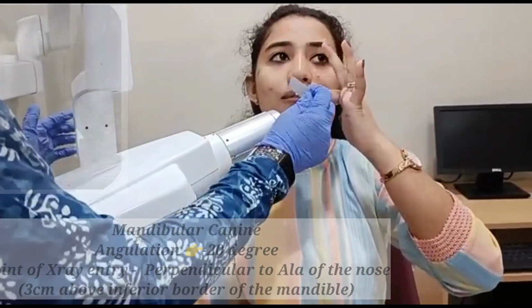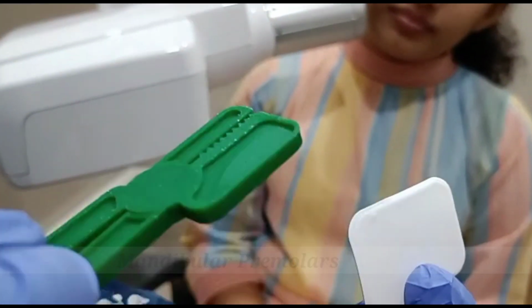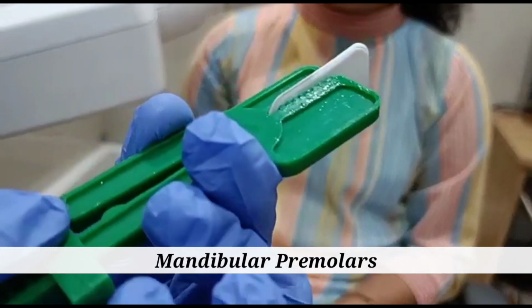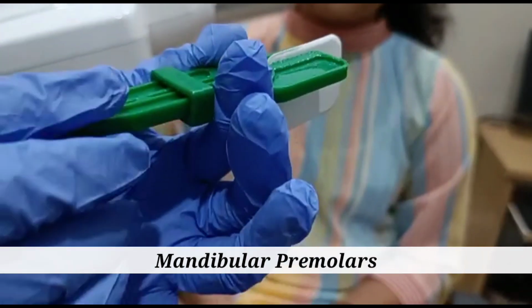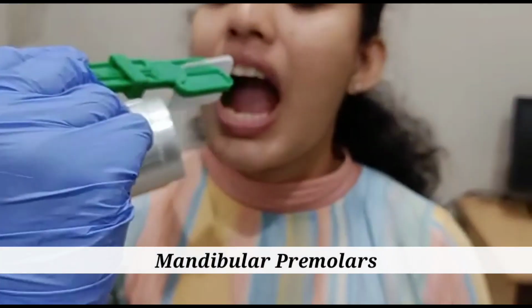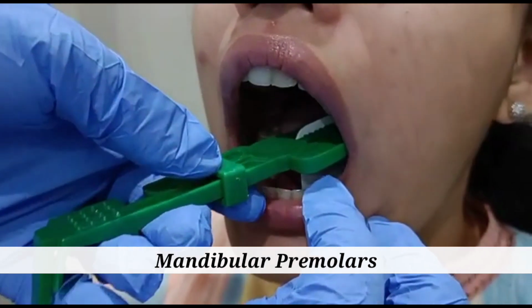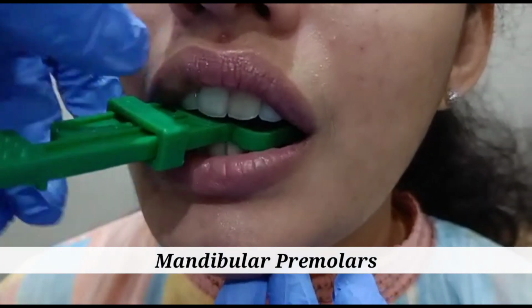Next we move on to the projection for the mandibular premolars. Now you can see that the occlusal dot must coincide where the Snap-A-Ray holder must be placed, and as I've already mentioned, the occlusal surfaces must coincide with the occlusal dot, and then we ask the patient to bite on the bite tab of the Snap-A-Ray holder.